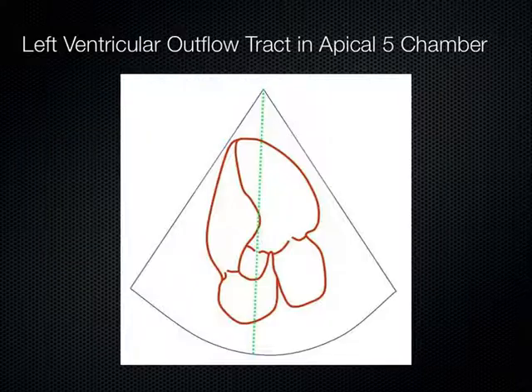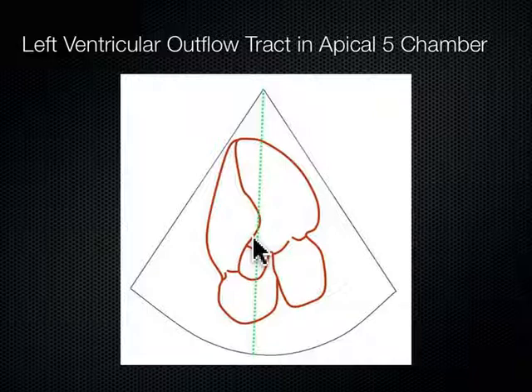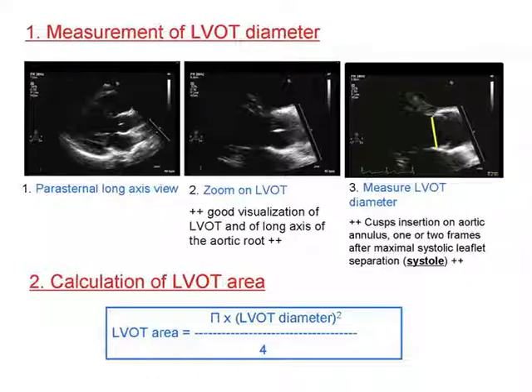Now, that left ventricular outflow tract seen in that apical 5-chamber view, this is just a schematic of it. This is where you're going to be dropping that Doppler gate right through here. And somewhere along that gate, you'll see that little TIE fighter looking thing. That's going to be right on the edge of this aortic valve, just right along here. That's where we're going to be dropping that Doppler little TIE fighter, in this general vicinity. And that will set us up to measure the cardiac output. Let me show what I mean.